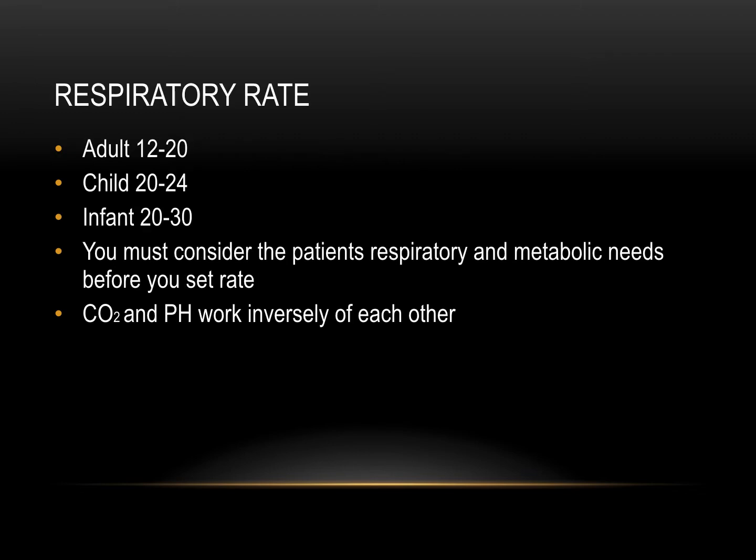So respiratory rate. We should all be really familiar with respiratory rate by now. If we're not, go ahead and hit pause. Go back to your EMT or paramedic textbook, do a little bit of reading, come back and finish when you understand what respiratory rate is. But when we talk about manual or mechanical ventilation of a patient, we can't just put everybody at their normal respiratory rate. So here I've listed the adult, child, infant respiratory rates that are normal ranges.